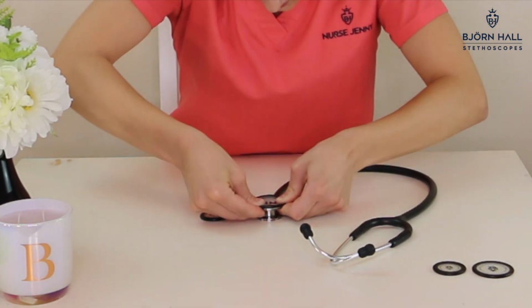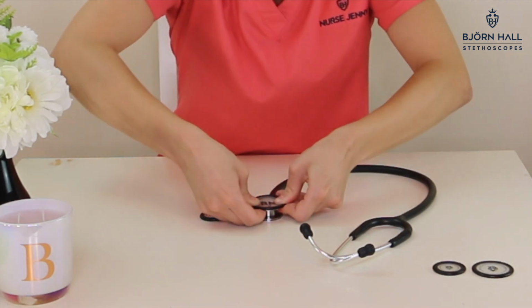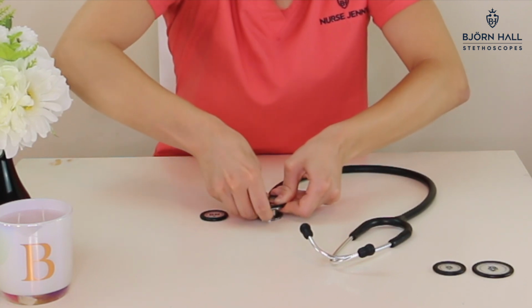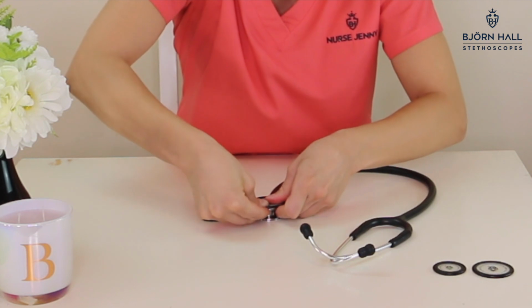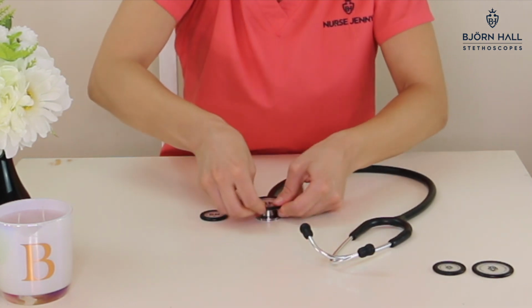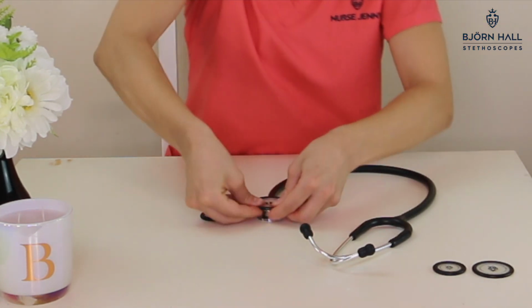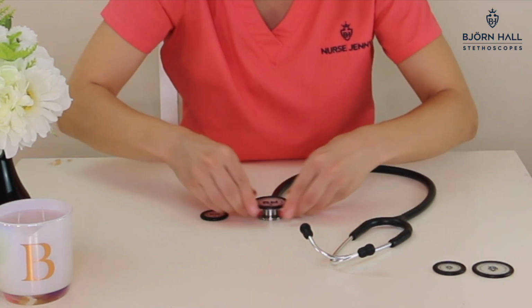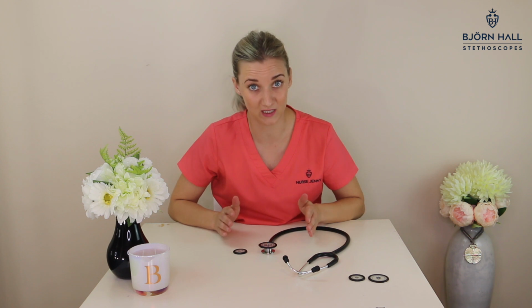You're gonna walk it all the way up, pushing in. You're gonna walk it all the way down. Keep pushing in the whole time until you feel they're in properly. Keep walking around until you can tell that they're all in place, and then keep pushing. Now I've just made that look pretty easy because I've done it many times, but I do know that this is quite tricky. And I'm going to show you some troubleshooting tips and tricks later on in this video.